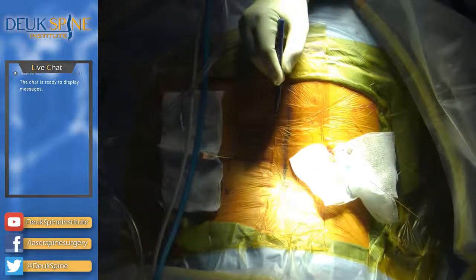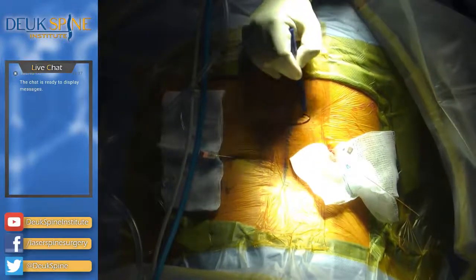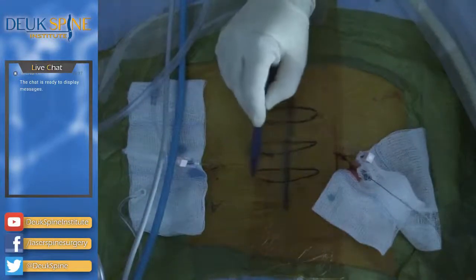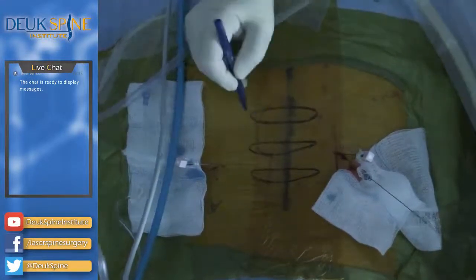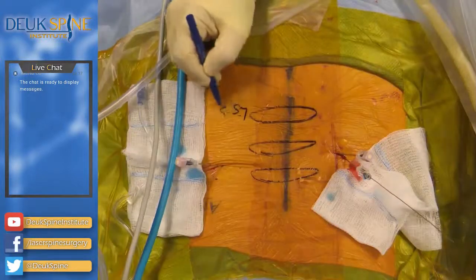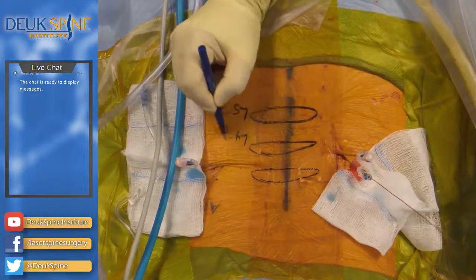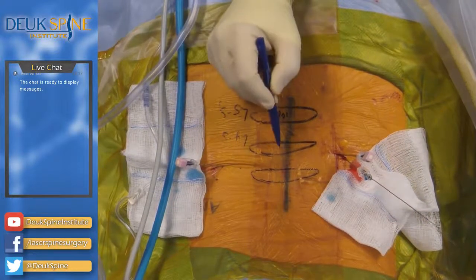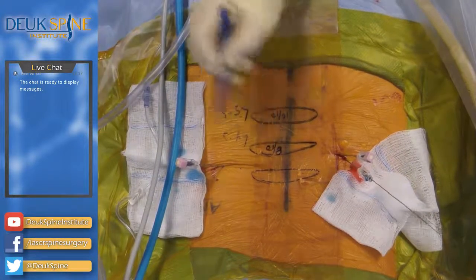All right. Nice. So we tested the L5S1 disc, and it was pretty darn collapsed. And then we tested the 4-5 and then the 3-4. What did we say L5S1 disc pain was? A 10, right? It was a 10 over 10. And then L4-5 was an 8 over 10 concordant.